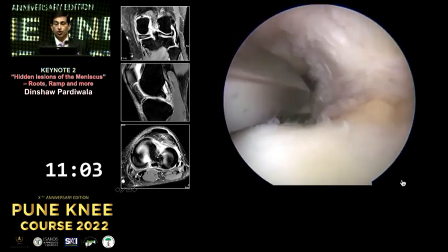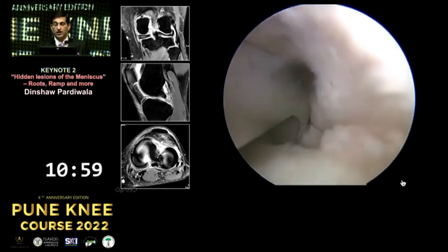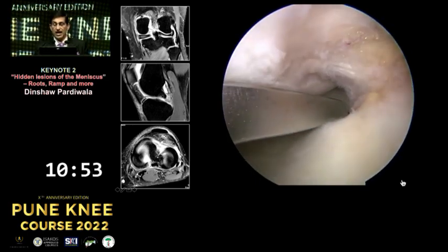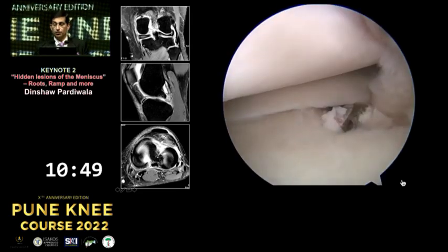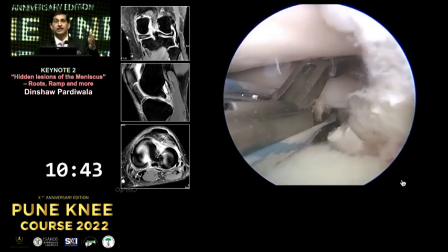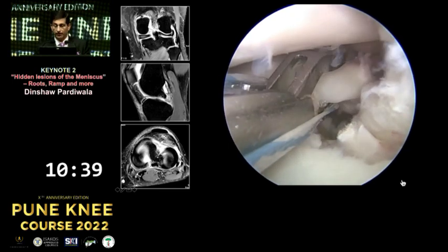Then you put your jig in there, and now you can get these special aimers, both for the medial and the lateral. So these are curved, so they are left and right. And once you've aimed for your anatomic footprint, you put your drill in there. This tends to be posterior and medial, and you have to have it anatomic, as these studies have shown. If it's non-anatomic, you probably will not get the correct forces.